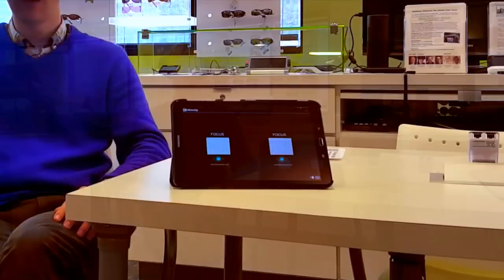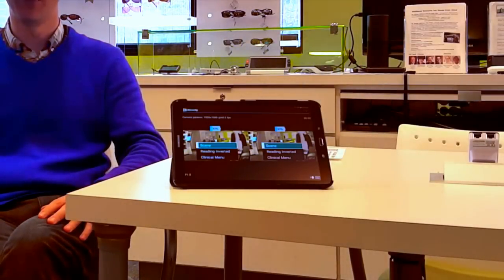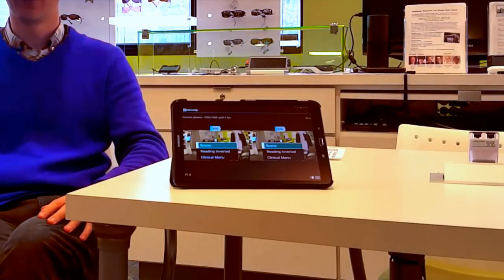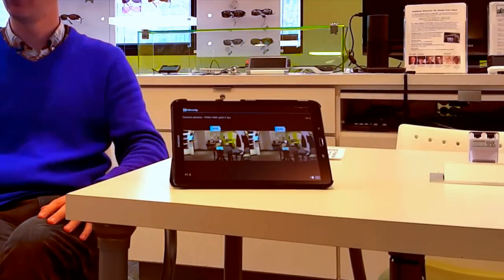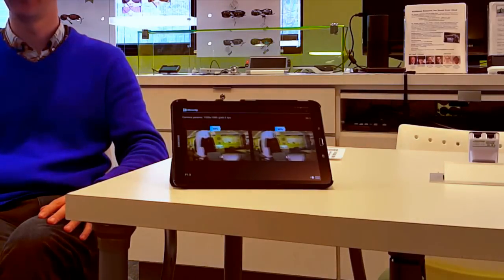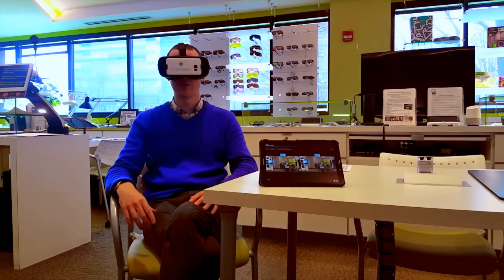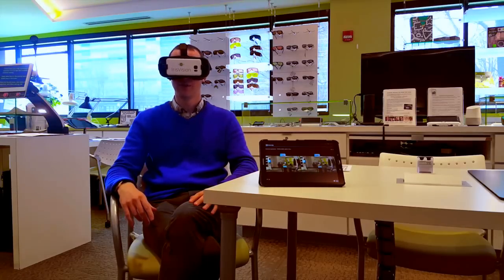And now we're through to our live video mode. So I can now look around the Lighthouse store, and this is in real time. Okay, so far so good.